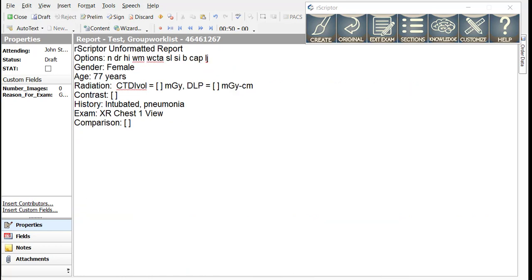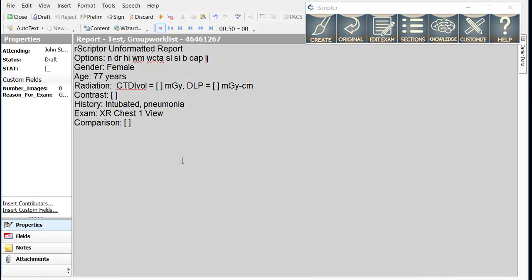Now let's look at a dictation for a morning portable X-ray. We will dictate some abnormal findings as well as use smart macros for placement of several devices.